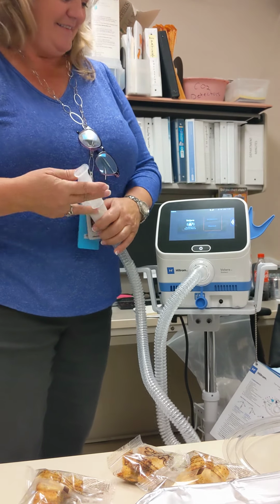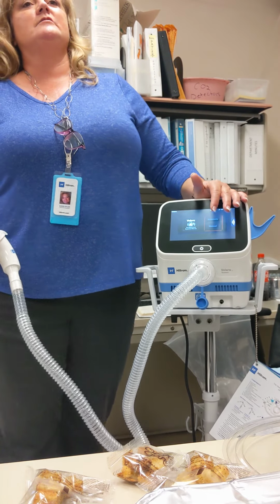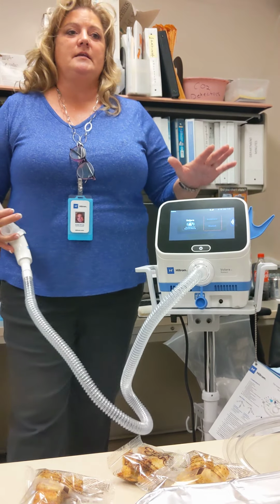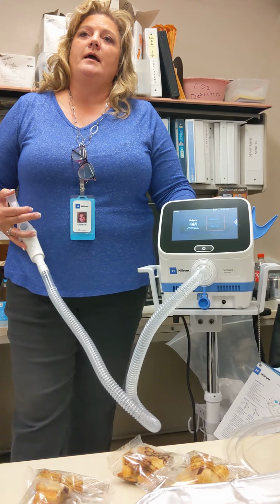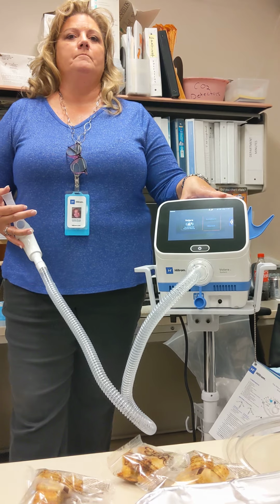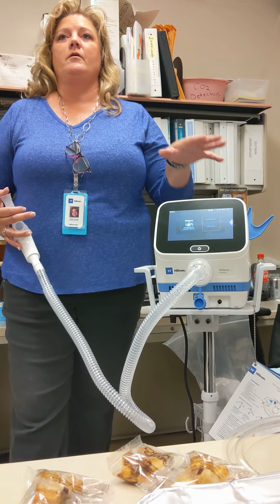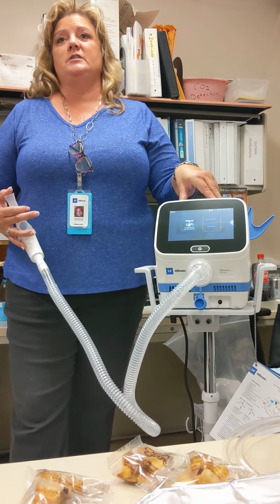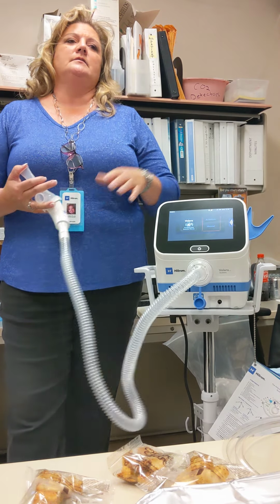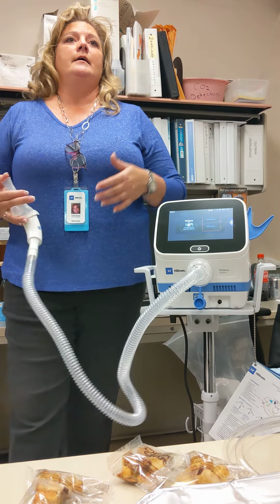So, to start the device, turn it on, and then in the hospital setting, we're going to use manual. Home care, now we are working on a CPT code. Once that CPT code happens, right now when you have a patient that could use this device long term, that's where you call Chris and you get the paperwork from him. They do a prior authorization. Because we're still working on our CPT code, the HCPCS code, Hillrom, just a little history fact, was the first company that got the HCPCS code for the VEST device. It took 5 years.